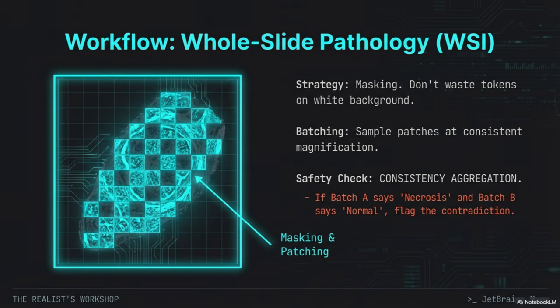And that prompting strategy in step 6 has to be sharp. You need to be specific. For example, list suspected findings with confidence. If you can't assess something from these specific slices, explicitly state that. You're telling the model what to do, but also what to admit failure on.